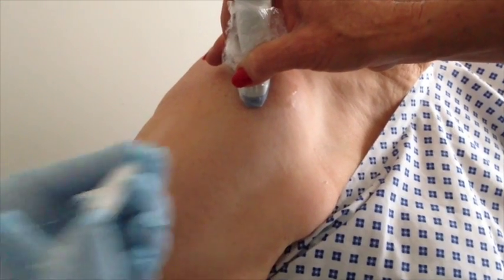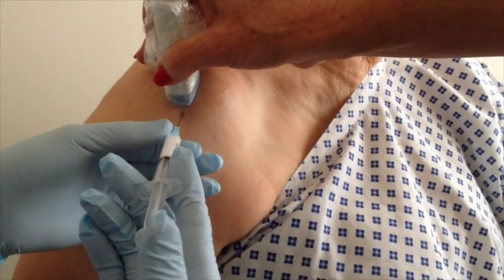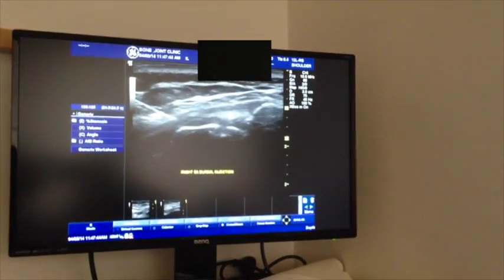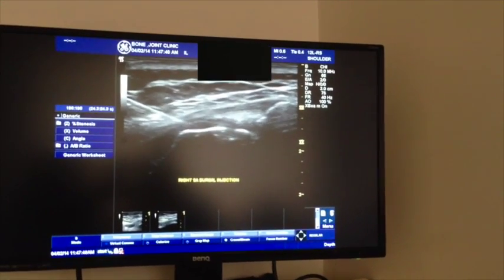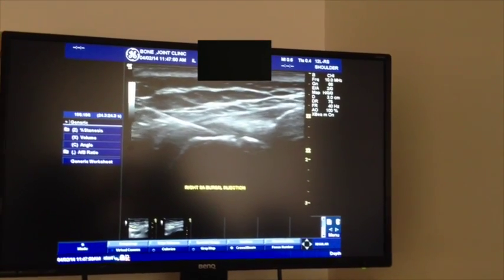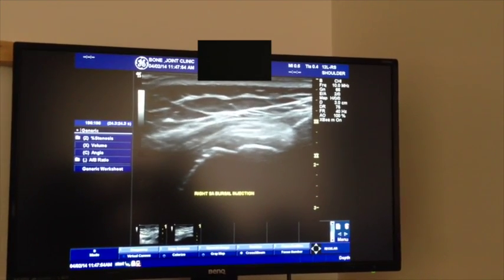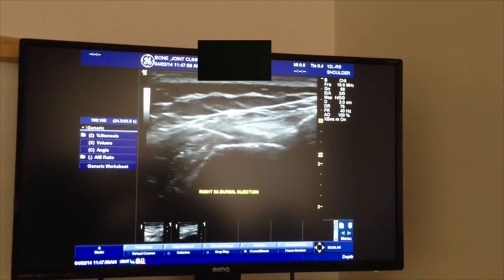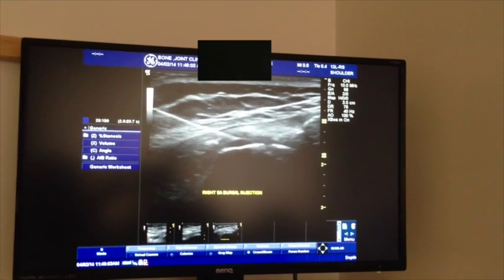So while Lisa's got the probe on, I'm going to go into the space now. And on the screen you'll be able to see the needle coming into the space. And we're going to get into that space now. All right, so we're into that subacromial space. And you'll now feel a sensation as I inject the fluid — it's a bit of cortisone and anesthetic. And that's done.